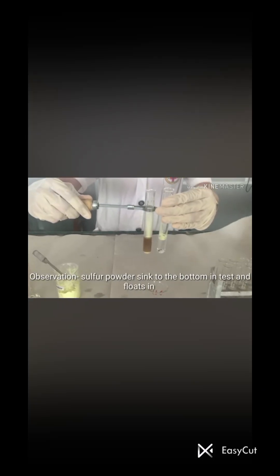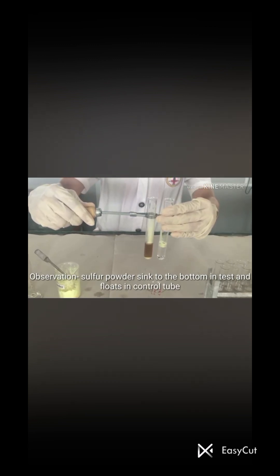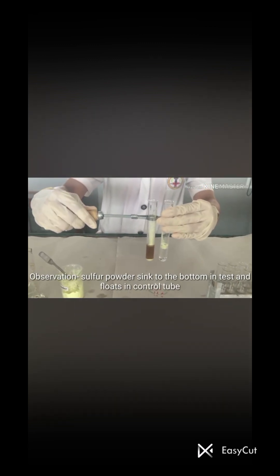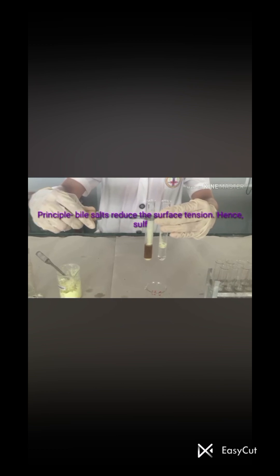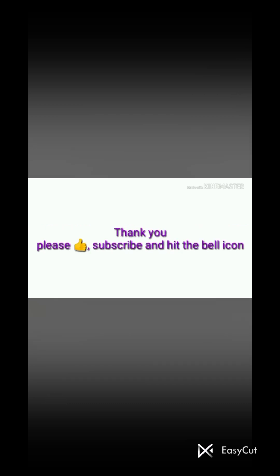Now we compare this test tube with the control. On comparison, we see that the sulfur powder sinks to the bottom in the test tube, while the sulfur powder floats in the control tube — which indicates a positive result. The principle is that bile salts reduce surface tension, and hence the sulfur powder sinks to the bottom.